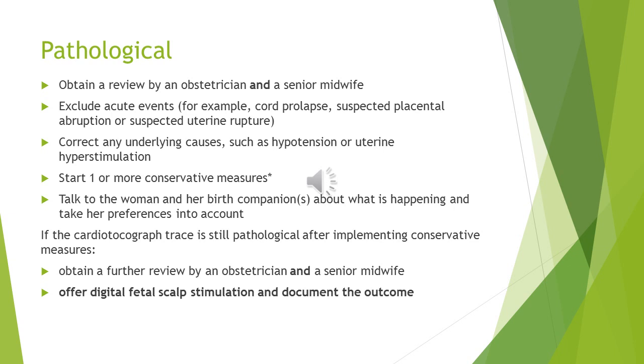So while you're examining the woman vaginally, you stimulate the fetal scalp. Usually if the baby is healthy, this stimulation will lead to acceleration, so this is reassuring. If it happens, it's reassuring. You need to document that. So you'll write fetal scalp stimulation positive, fetal heart rate acceleration, and then you'll write your plan about what you need to do after that.